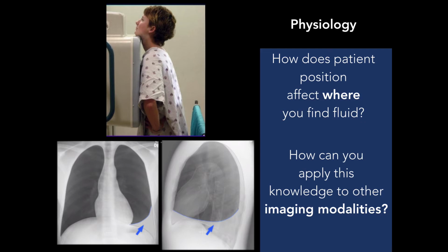And if you had a pneumothorax, it would be up at the top, right? Whereas if you were laying flat, it would be layered anterior up here and you would miss it. Do you see how we are applying the information? All right, you want to apply it a little bit more? All right, let's apply it a little bit more.